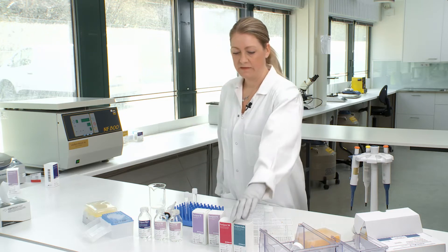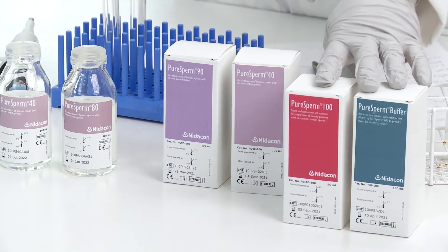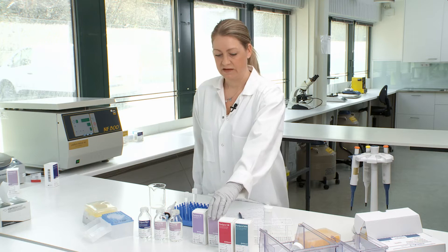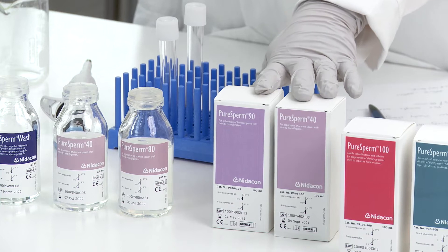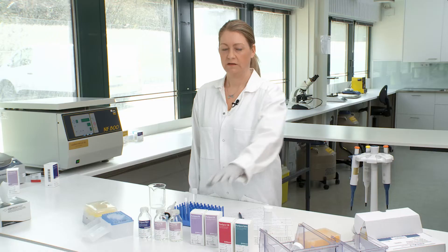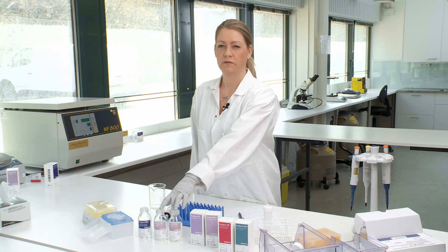First of all we have the PureSperm 100 and the buffer system where you prepare the gradients yourself, mixing them to the desired density that you want. Then we have the PureSperm 90 and PureSperm 40, which are ready to use, and the PureSperm 40 and PureSperm 80, which are also ready to use. The PureSperm 40 and 90 will give you a higher percentage of motile spermatozoa, while the PureSperm 40 and 80 will give you a higher yield.